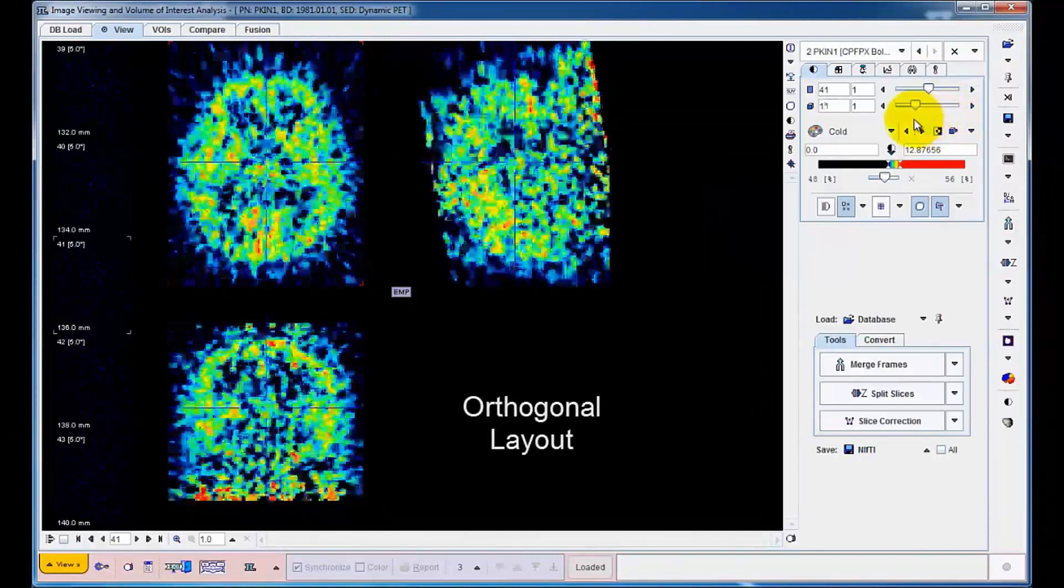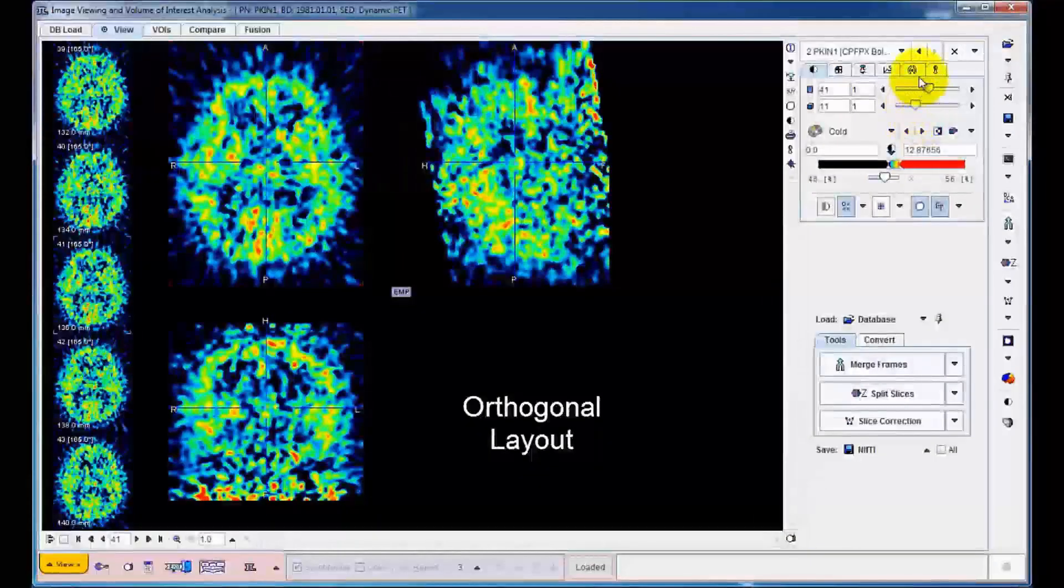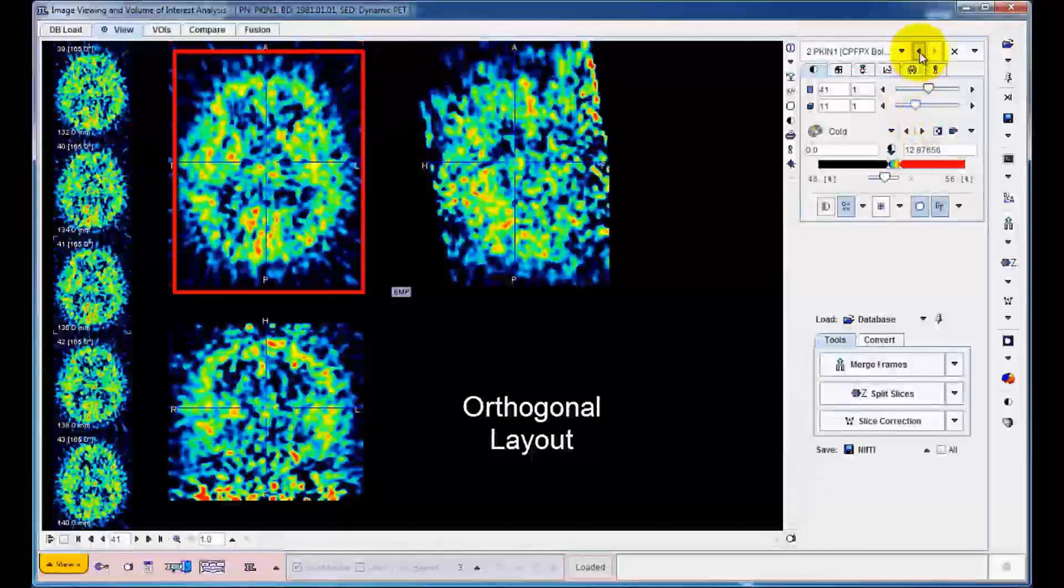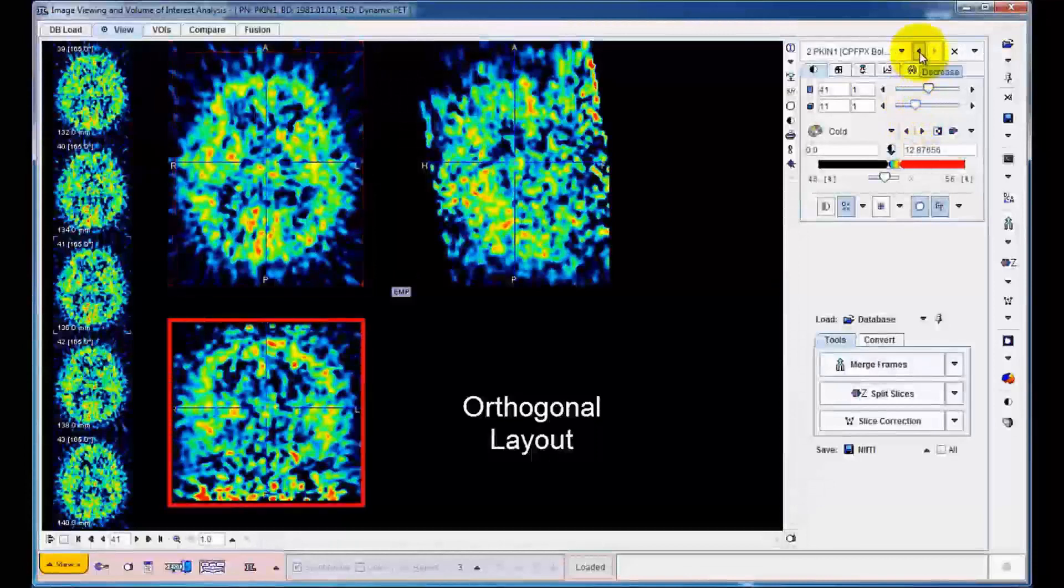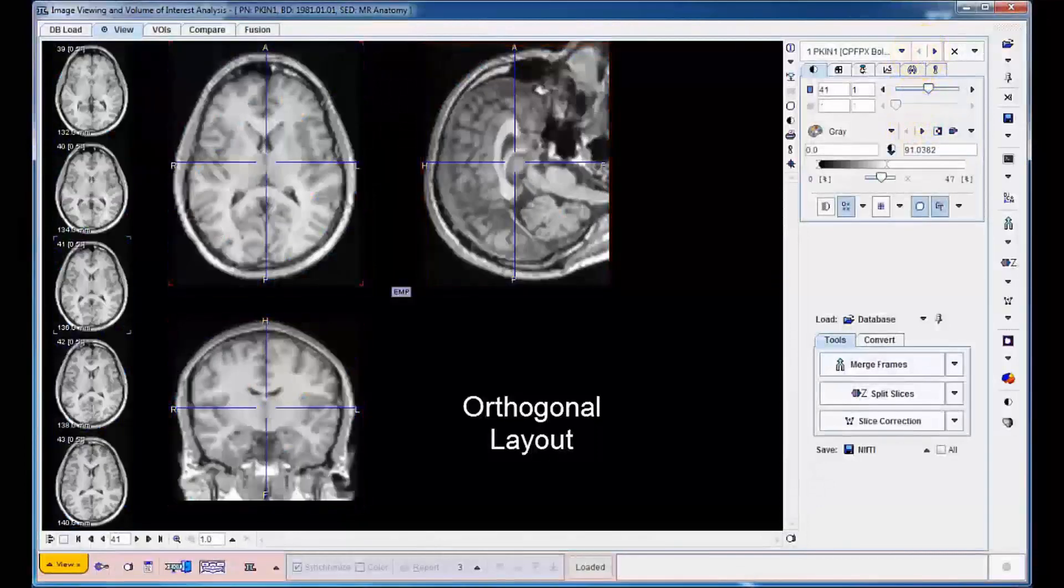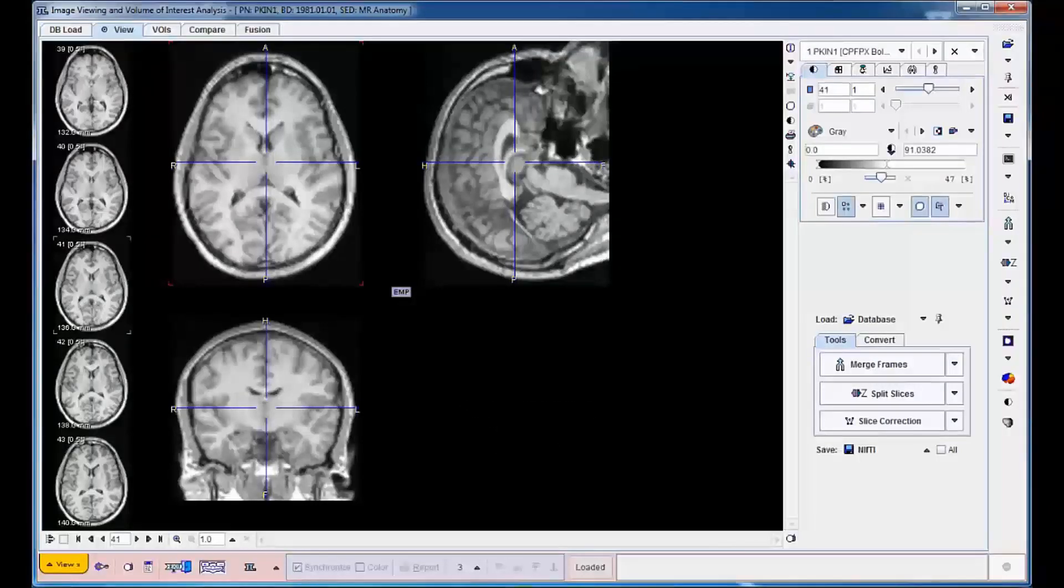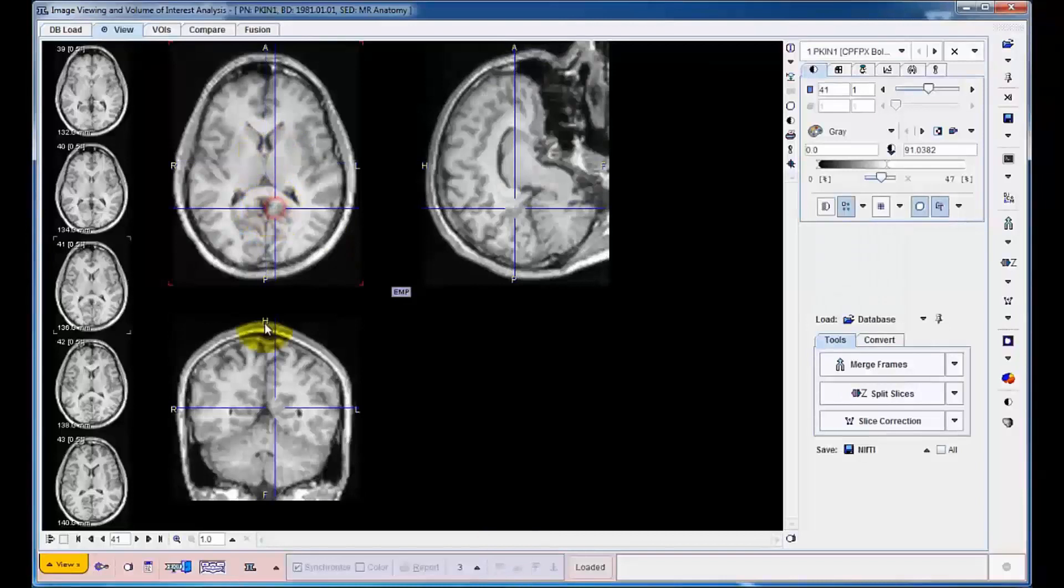The current layout uses orthogonal planes in the axial, coronal and sagittal axes to give an overview of the image. The plane intersection point can easily be redefined by clicking on the image planes.